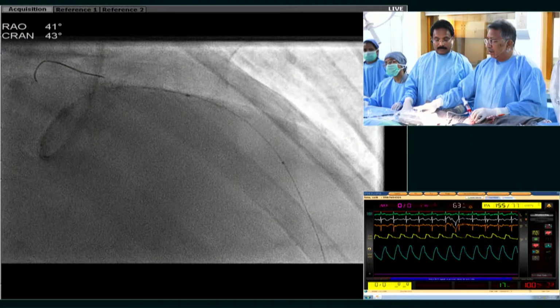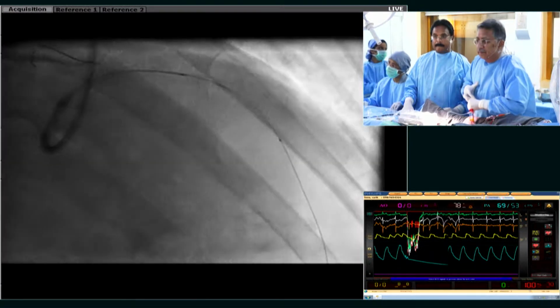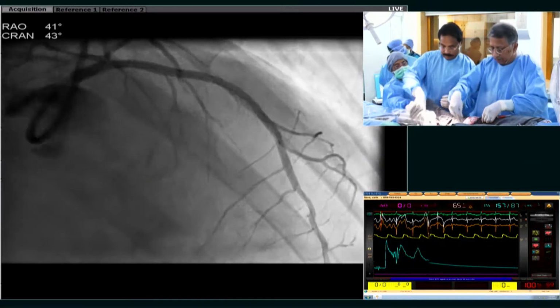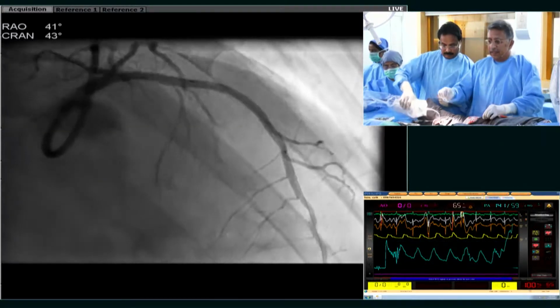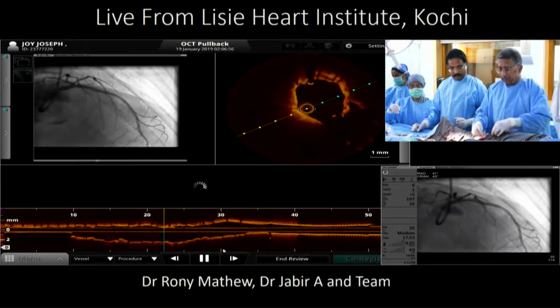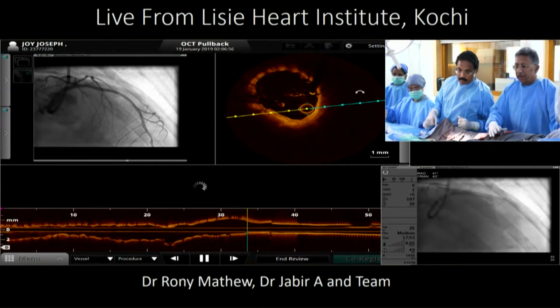Mathew, you've been talking about these struts across the... One second. I'm just doing this pullback here. Calibrate. Right, let's have a look at that recording and let us decide about that. Can you get OCT to the main screen, please? Good. Get me a rendered image of the bifurcation point.